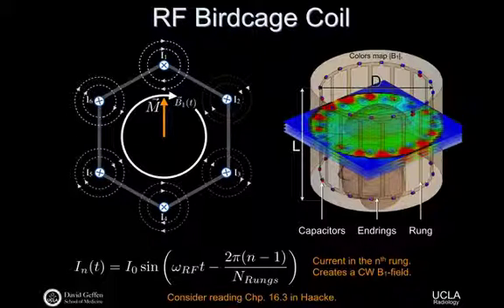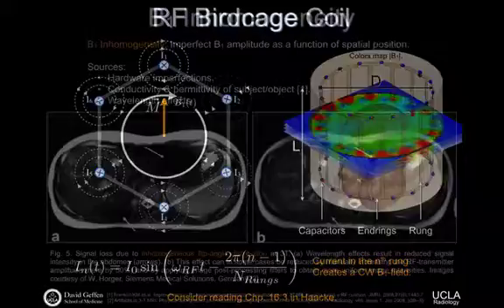I don't always want to get to the transverse plane. Sometimes I just want to tip 10 degrees. Sometimes I want to tip 180 degrees. There are different circumstances for that. But conceptually, this is what's happening.